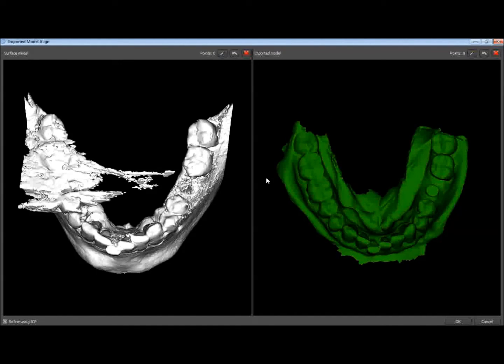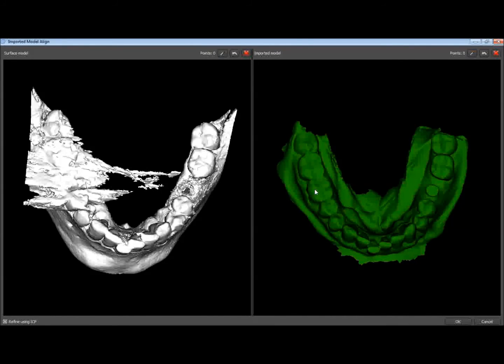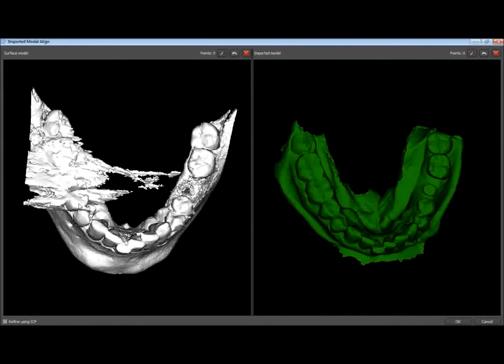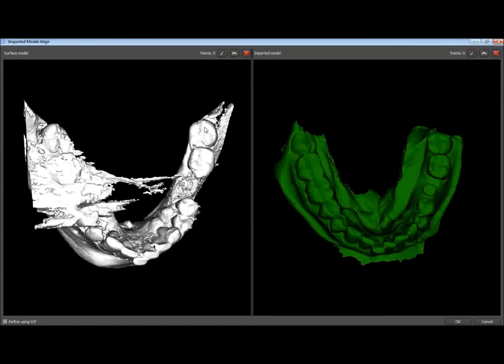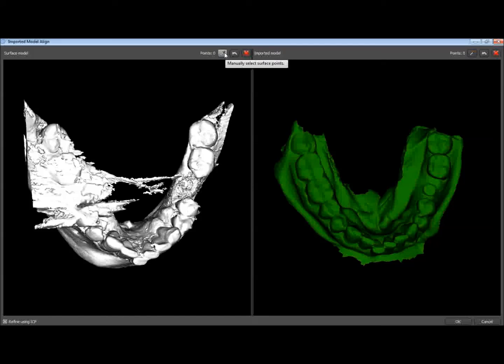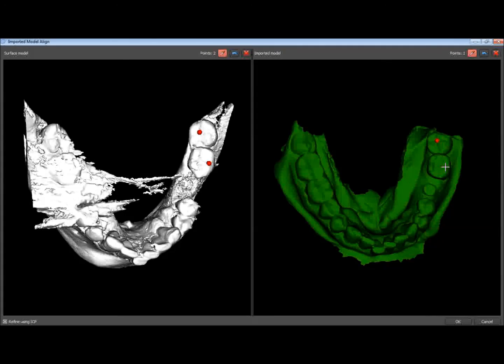You can see it's a clean image. We can get a nice guide fitted onto that. There's no scatter on this image here. So what we're going to do now is align these two images by picking some points. We usually pick about seven points and we try to get them in different planes. So we'll start picking points. Here's a point of similar information. Pick another point right here in this groove.